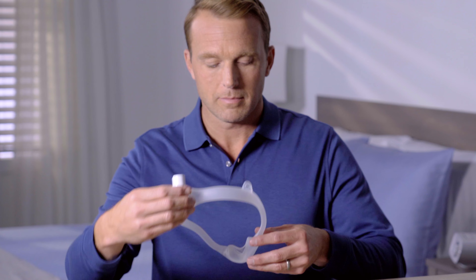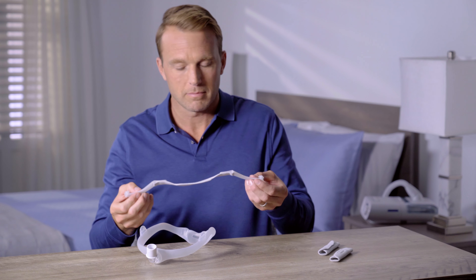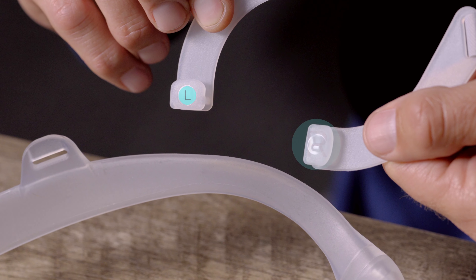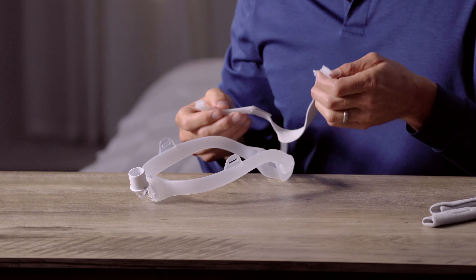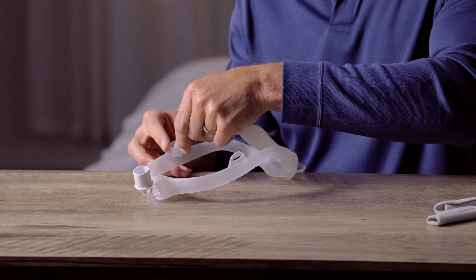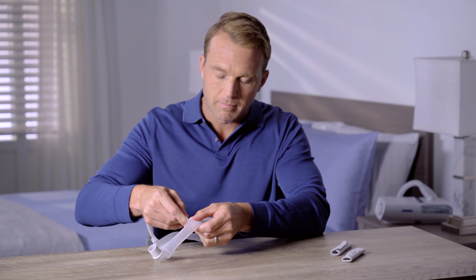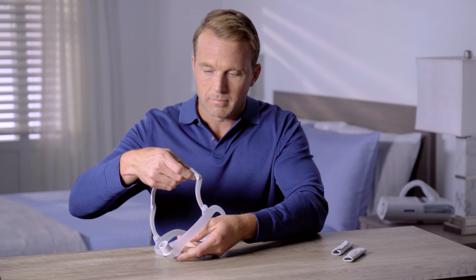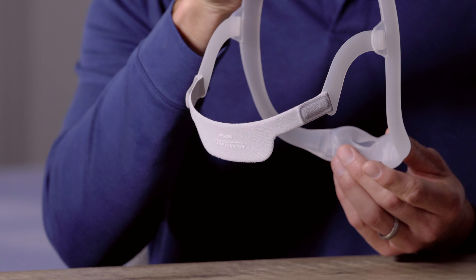To add the headgear, position the mask with the cushion facing forward. Look for the R and L symbols on the headgear arms. Push the R headgear clip through the mask frame loop on the right, and the L clip on the left. When you're done, the R and L symbols should face outwards. The Philips Respironics logo should be on the outside, and the Dreamwear logo on the right.